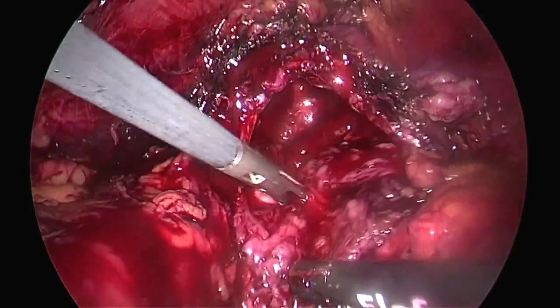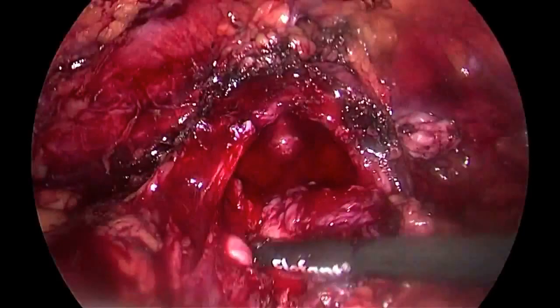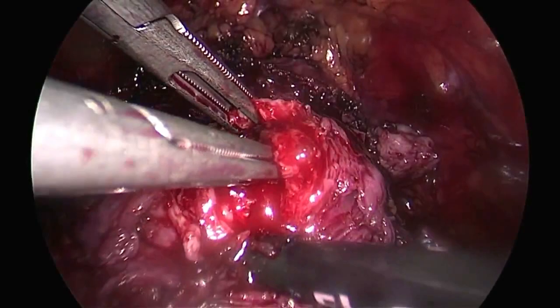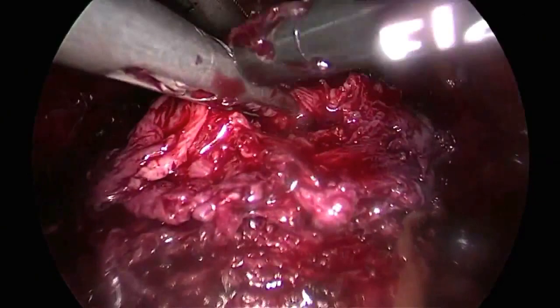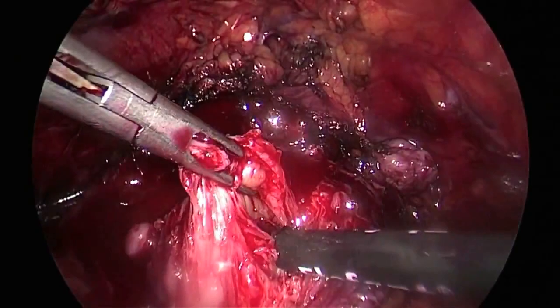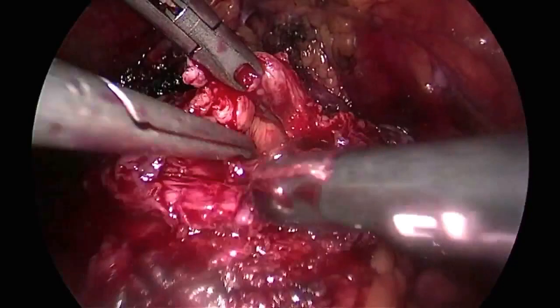This is adenoma again. Okay, bladder neck should be here. Can you give me another John? It's here. It's this one. Perfect. This is the bladder neck. As you can see, it's a little bit closed. I try to remove. This small adenoma that is here, I perform an incision here, and after I begin with enucleation.